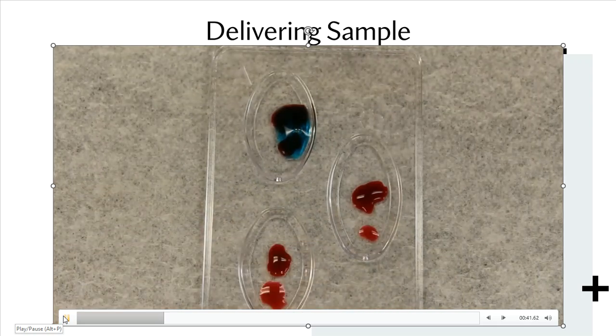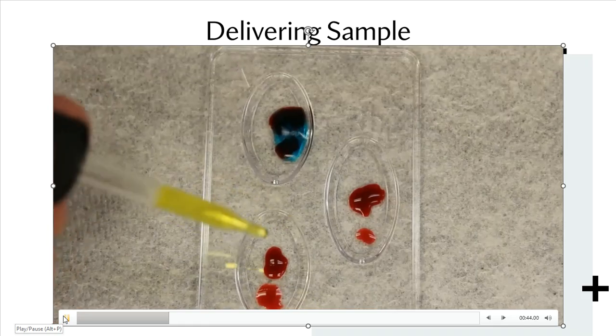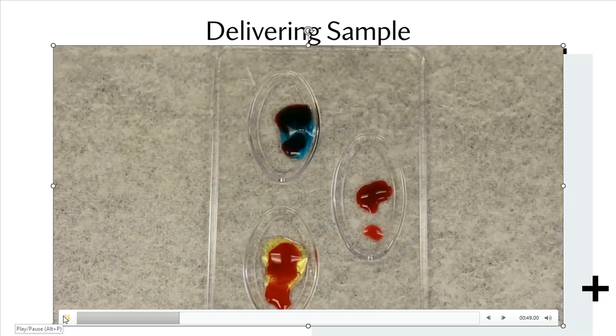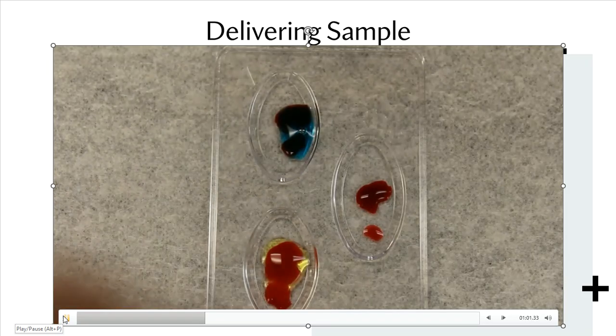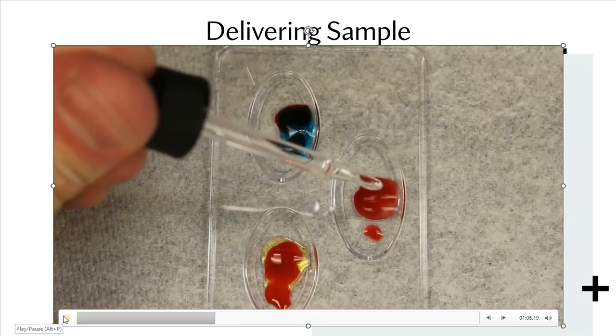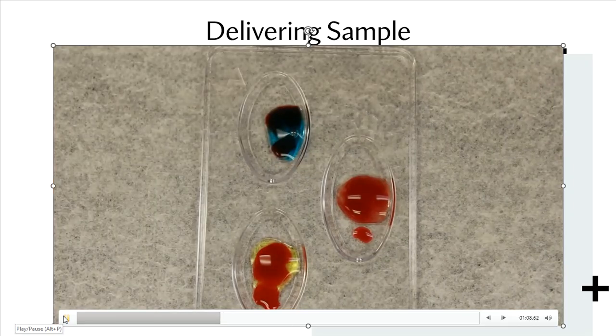So here I'm going to take my anti-B serum, and once more I'm just going to add 1, 2, 3 drops, give or take a little bit, get them all nice and juicy. And then finally my RH factor, and that is the clear one, and it will say anti-RH on the label. I want you to keep in mind that these are real anti-serums, so what you'll be using is actually real stuff. The reason I say that is because a lot of people assume that what we do in here is simulated, but it's not. It is real things most of the time.